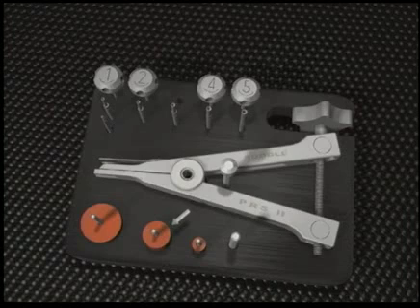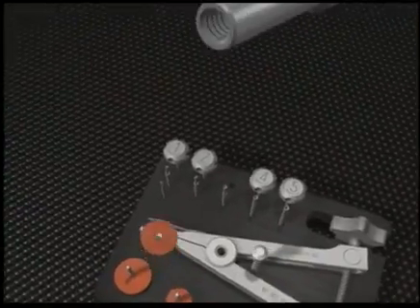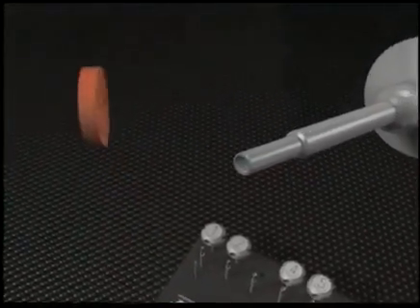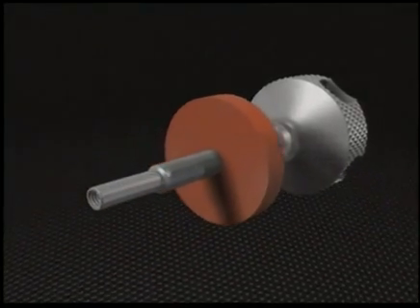A silicone cushion is selected such that it will not be displaced into the access cavity and will distribute the post removal loads evenly over the biting surface of the tooth. This bumper is placed over the working end of the tubular tap.